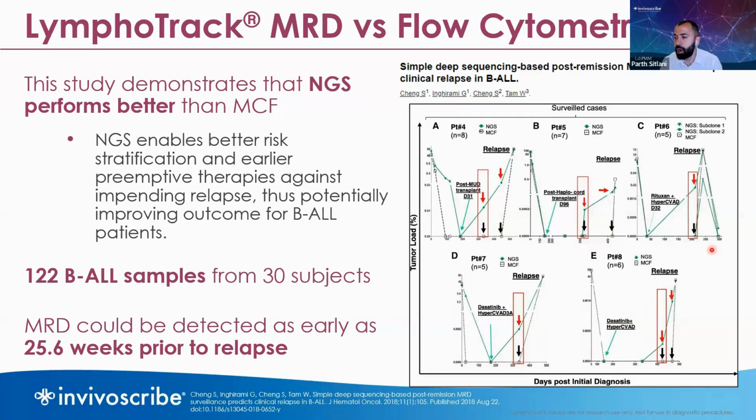There's a question about oligoclonal plasma cells that emerge during treatment. Yeah, we do see that, especially as we start looking at MRD testing of samples that are recently post-treatment, especially with, for example, CAR T therapies, where the population of B cells actually goes quite down, and then the repertoire becomes much more restricted in later steps.